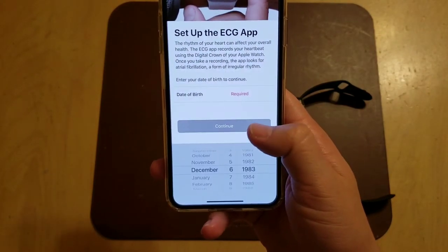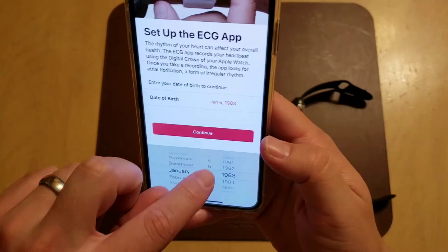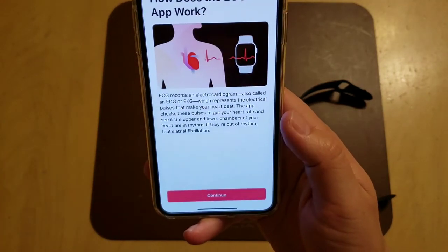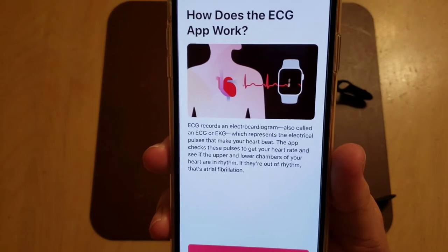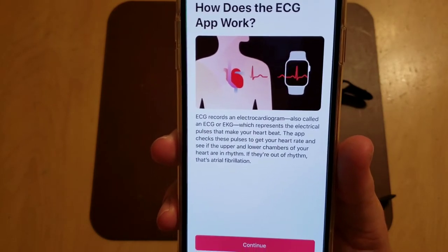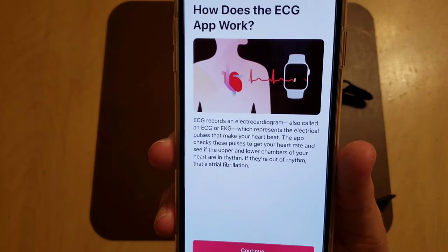You're going to have to put in your birthday to get that set up. Now it tells you how it works. The ECG app records an electrocardiogram — also called an ECG or EKG — which represents the electrical pulses that make your heart beat. The app checks these pulses to get your heart rate and see if the upper and lower chambers of your heart are in rhythm.